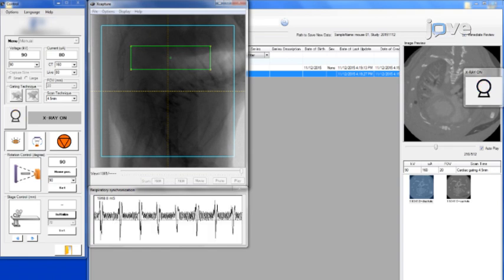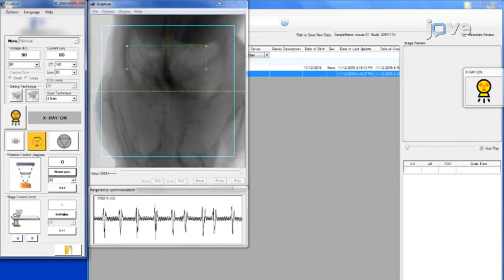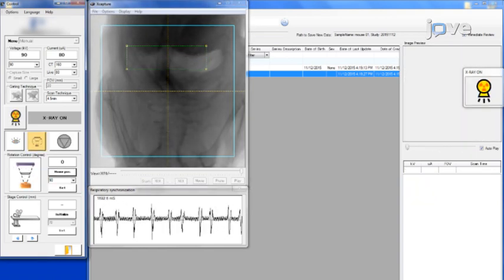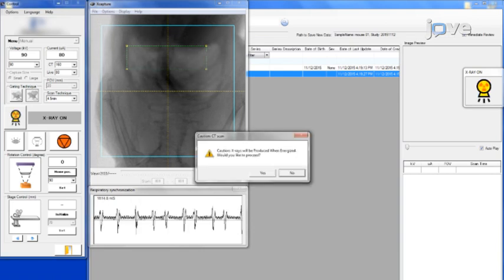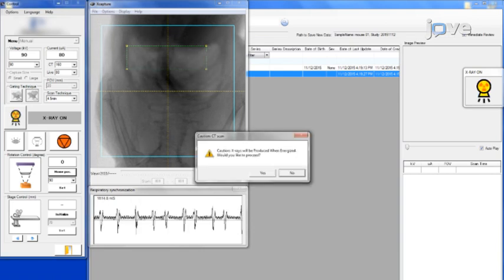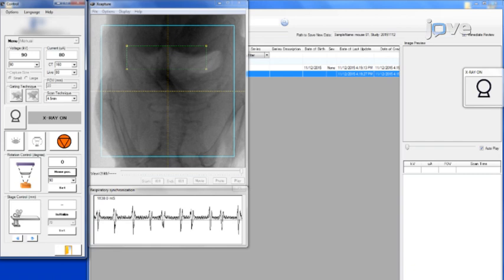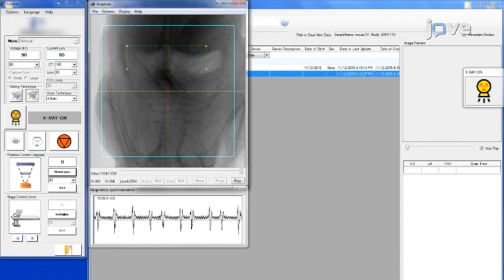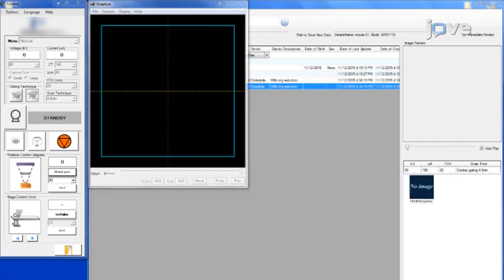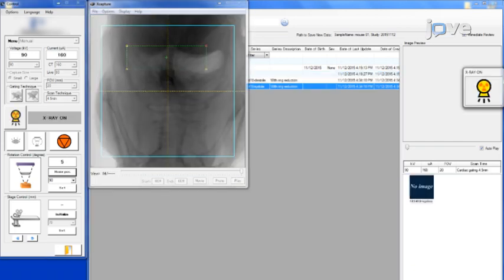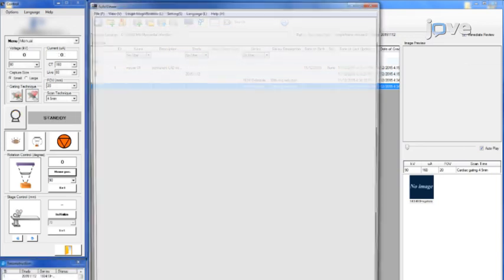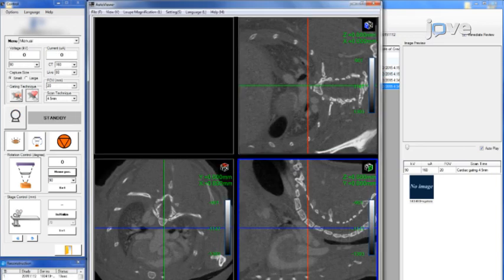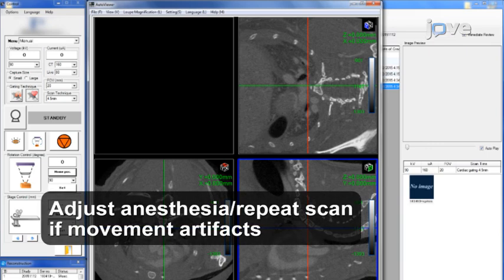When the animal is in position, click the CT Scan button to initialize the acquisition. The CT Scan confirmation message will appear — click Yes. The red x-ray energizing indicator will turn on the instrument and the scan will begin. At the end of the scan, observe the transaxial, coronal, and sagittal views of the reconstructions in the 2D viewer software.